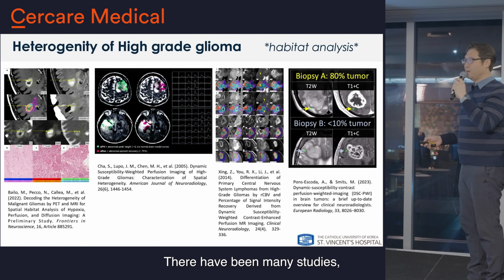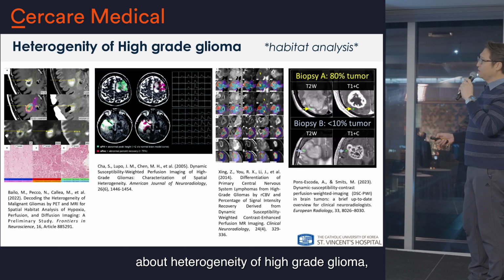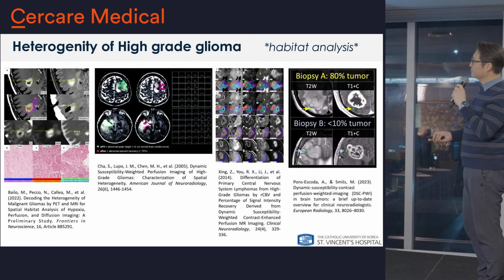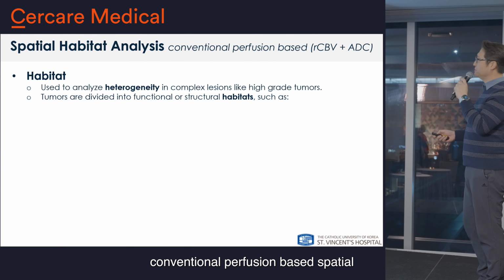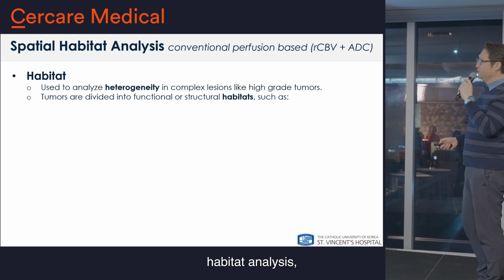There have been many studies about heterogeneity of high-grade glioma, so-called habitat analysis, as you know. This is about conventional perfusion-based spatial habitat analysis.